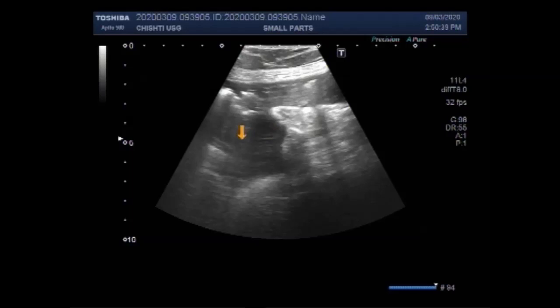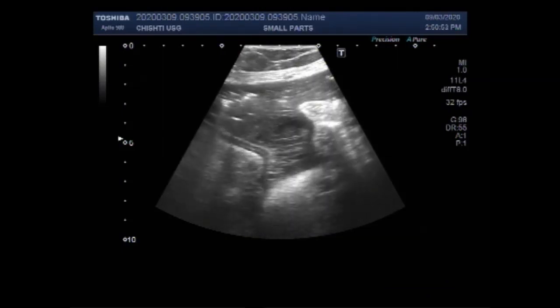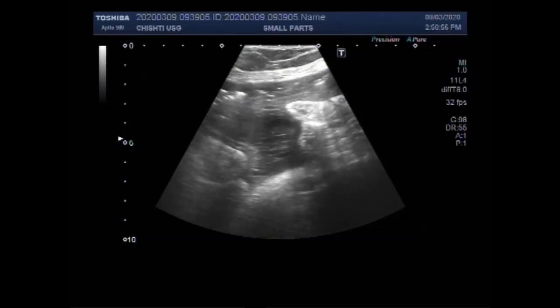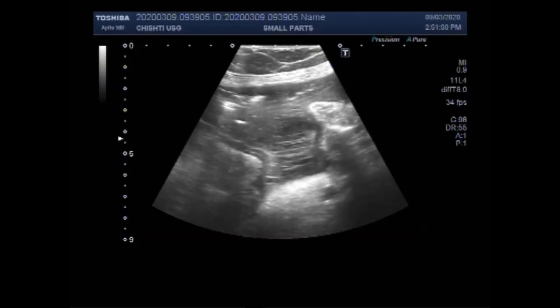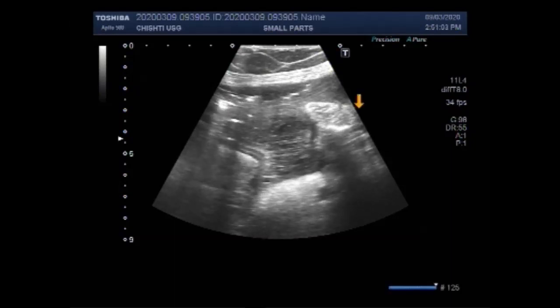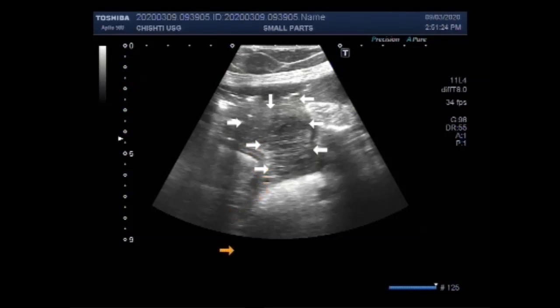Again, you can see these are the multiple adhesions seen with the high-power linear probe. In the first part of the video, the examination was conducted with a convex probe; this examination is being done with a high-power linear probe. You can see the multiple adhesions, as the patient has been experiencing this condition for about four days.